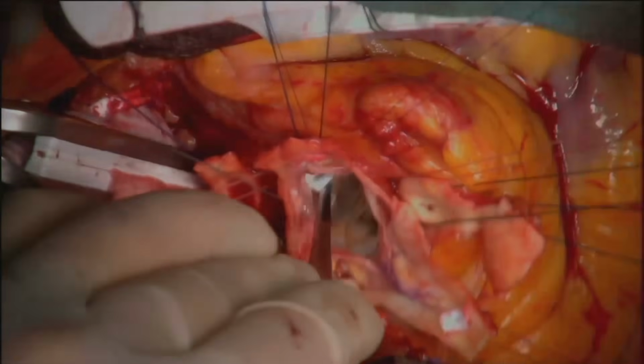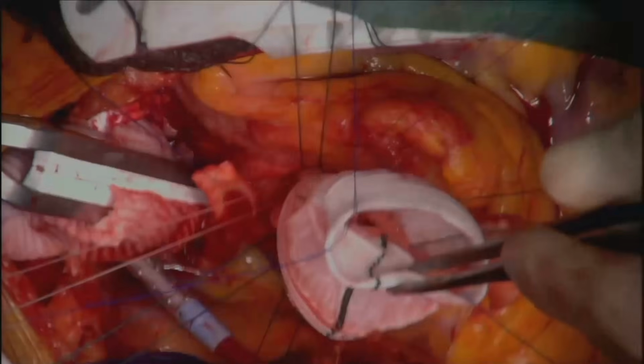A total of 7 plegeted sutures were placed. The plegeted sutures were passed through the graft and were tied down.